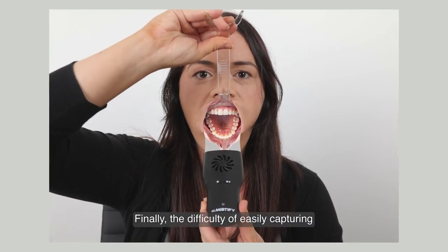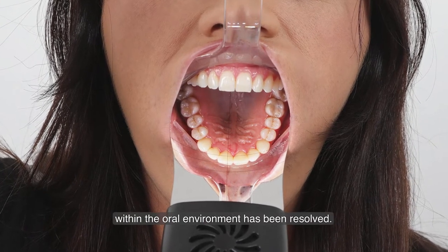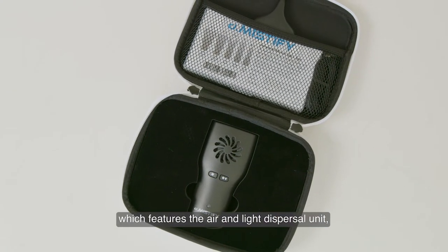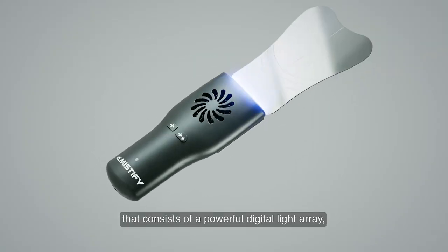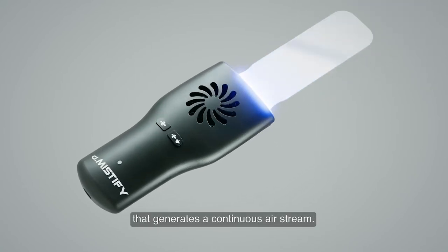Finally, the difficulty of easily capturing high-resolution imagery and data within the oral environment has been resolved. Introducing the Demystify ProData Capture Kit, which features the Air and Light Dispersal unit — a highly engineered device that consists of a powerful digital light array in combination with a twin-speed fan that generates a continuous airstream.